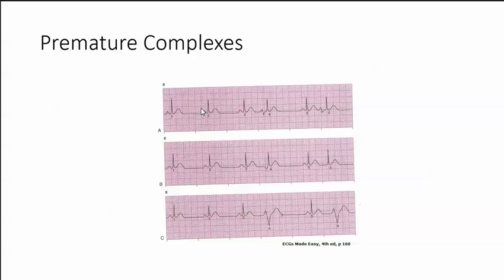Let's look at the first one. A normal sinus, normal sinus, normal sinus. Well, this one doesn't look normal — this looks normal but this one doesn't. If you take your calipers, the next beat should be right here, and on this one the beat after here should be right there. So you have a premature beat. Now look at the P wave here — it's definitely a P wave but it looks different. So you have a P wave that looks different with a normal QRS. This is a premature atrial complex.